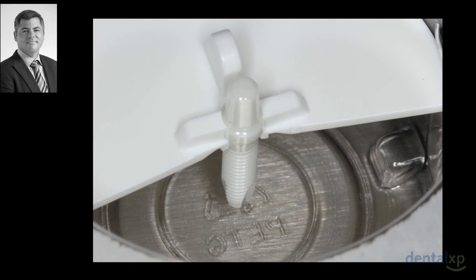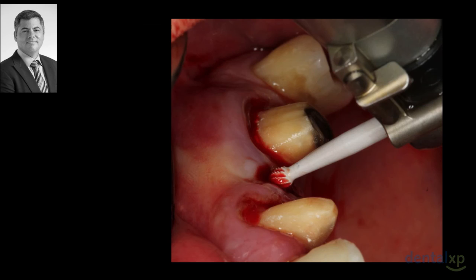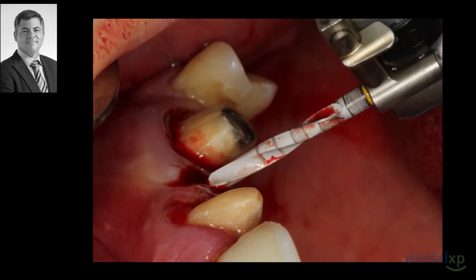This is the implant, and we're going to tissue punch the area, minimally invasive surgery. Look at the soft tissues again. Remember that we did some work over there before for the sinus elevation. We start with the pilot drill and continue with each one of the drills. I'm showing it this way so you see the actual sequence, but this was also computer guided.